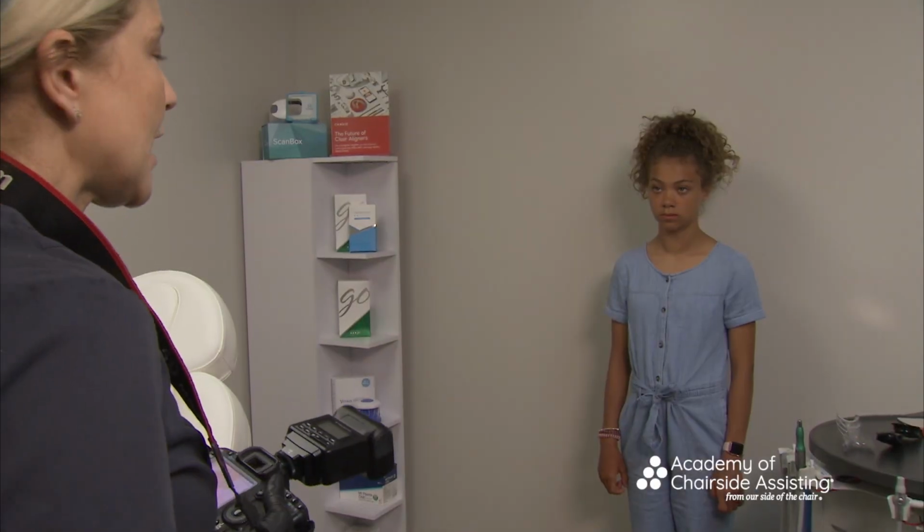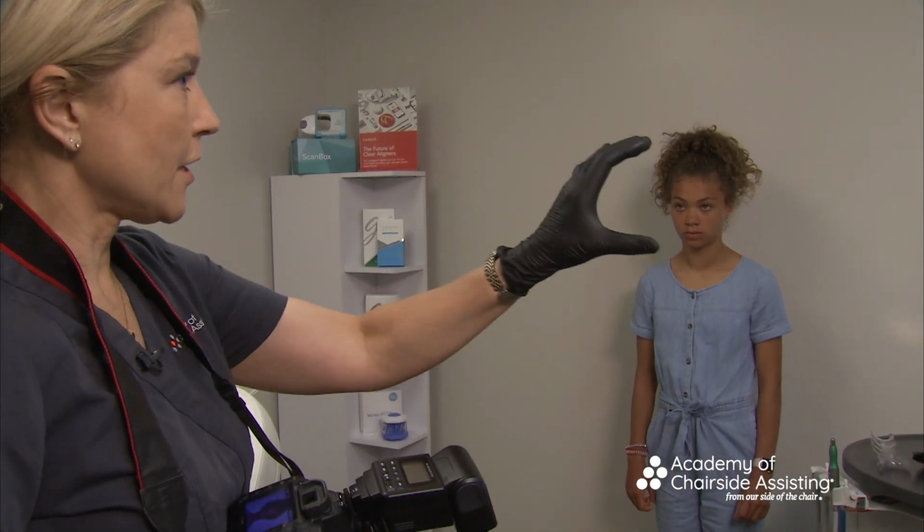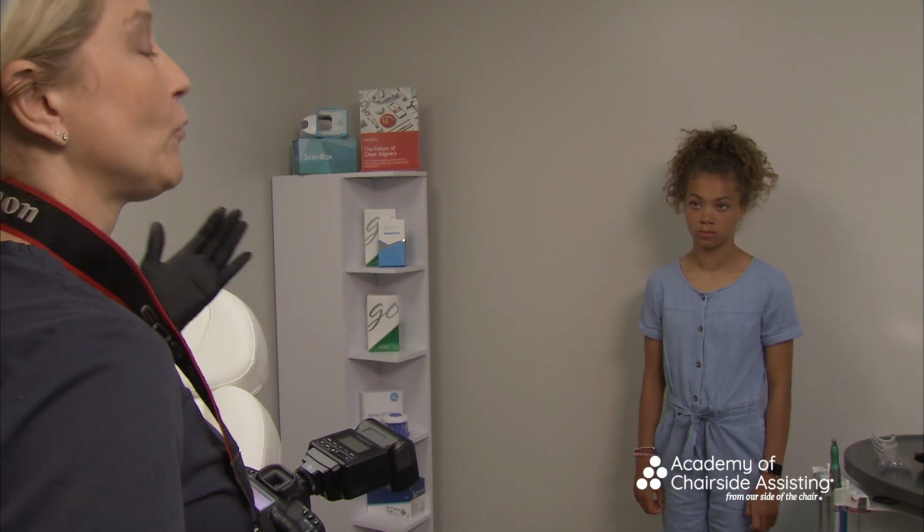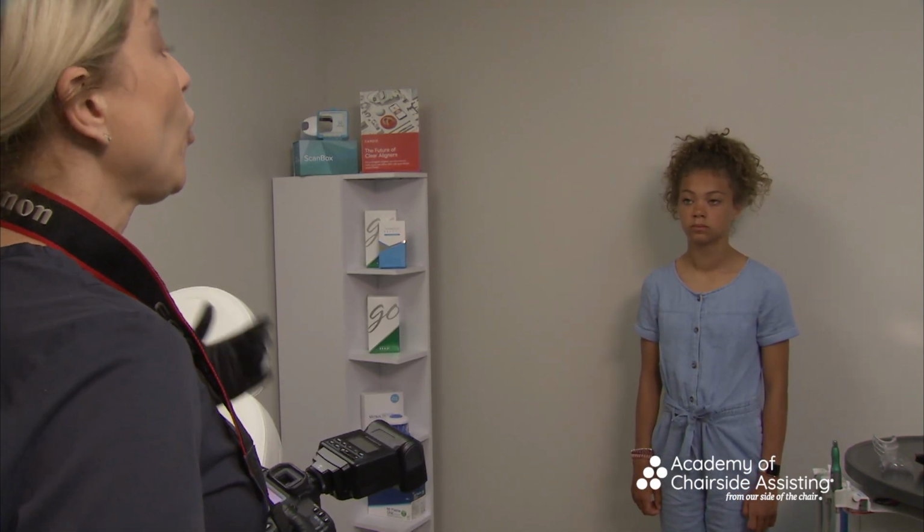That light tells us that we're in the right place. Now, a lot of times that's perfect and we don't have to really make any changes, but we went horizontal. My doctor likes to see vertical, and we use that, again, a lot when we're referring to an orthodontist or when we're utilizing it for laboratory communication.